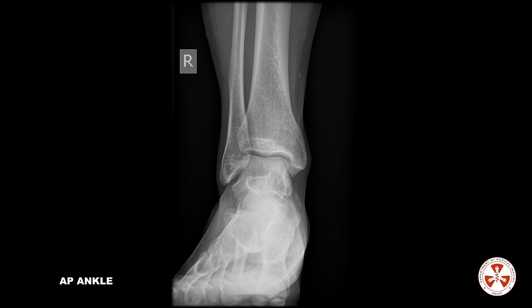A diagnostic AP ankle must show an open medial mortise joint, while the lateral mortise will demonstrate natural superimposition of the fibula and tibia.